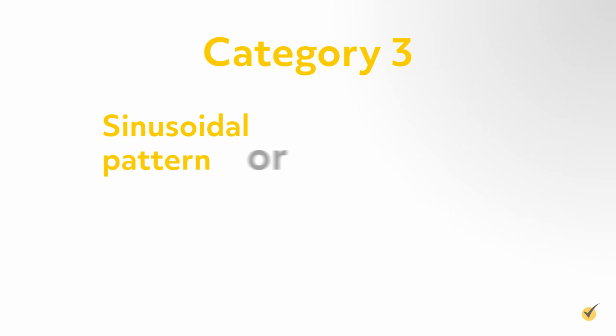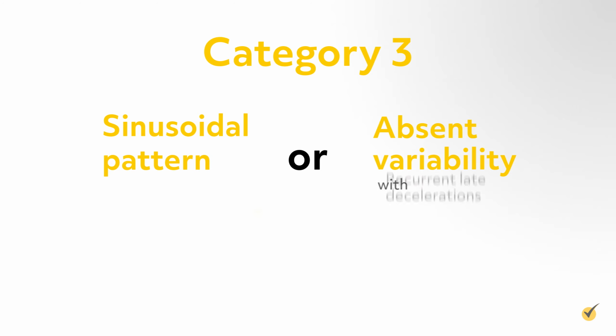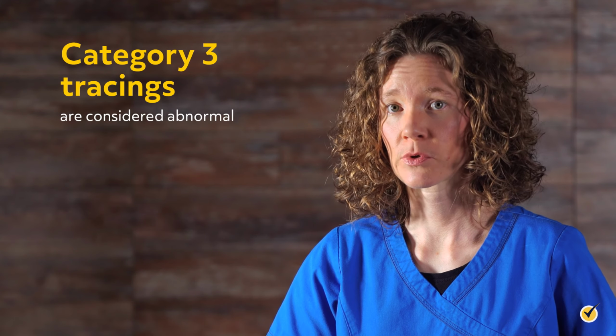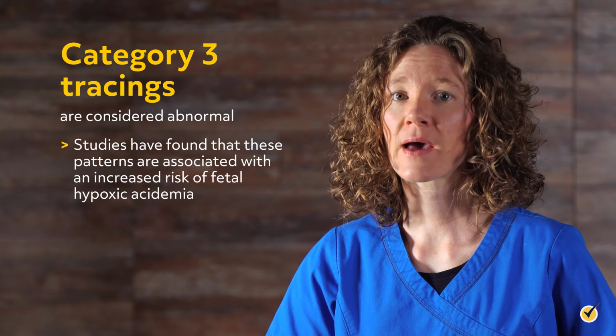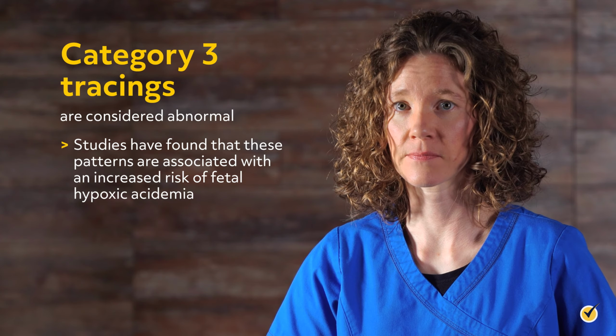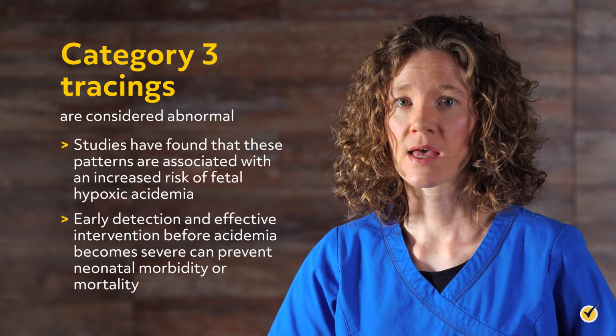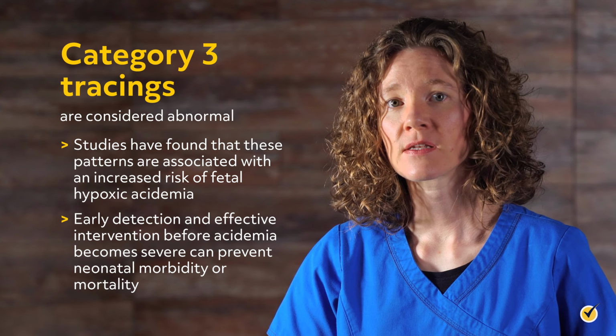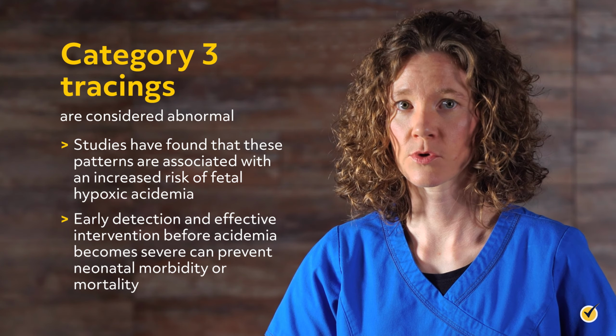Let's jump to the Category 3 pattern, which is defined as either a sinusoidal pattern or absent variability with recurrent late decelerations, recurrent variable decelerations, or bradycardia. Category 3 tracings are considered abnormal because studies have found that these patterns are associated with an increased risk of fetal hypoxic acidemia. Early detection and effective intervention before acidemia becomes severe can prevent neonatal morbidity or mortality.